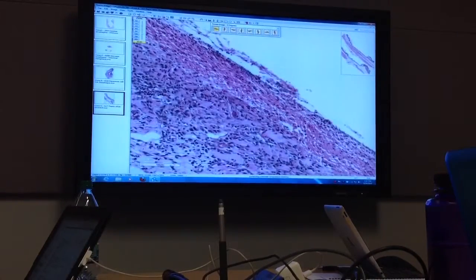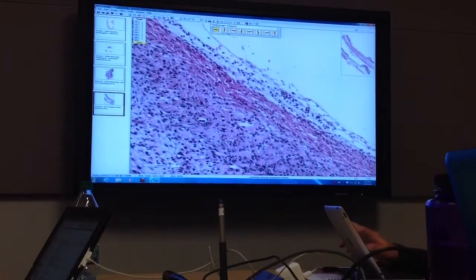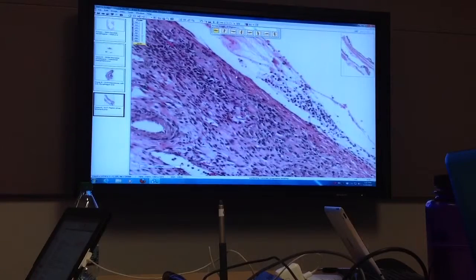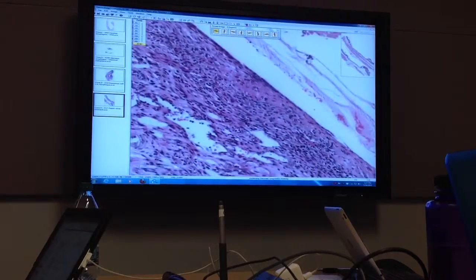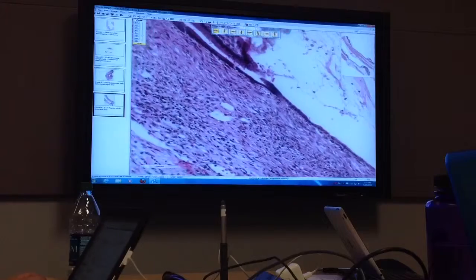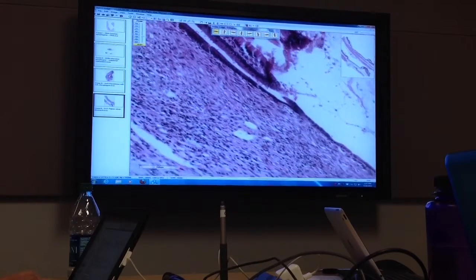So this thing is huge. If we're in the stomach, and this is a big ulcer, I think we could call it a peptic ulcer. Why not? So this is a great big ulcer. Okay. Do we think this is neoplastic or just inflammatory reactive? Inflammatory, right, because of all the things we just talked about.